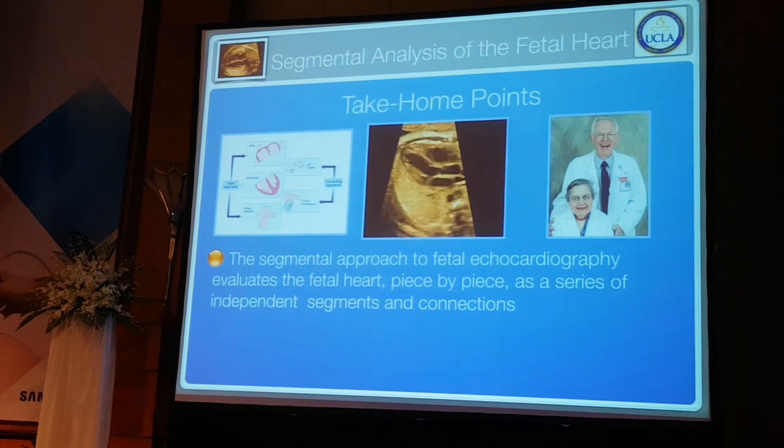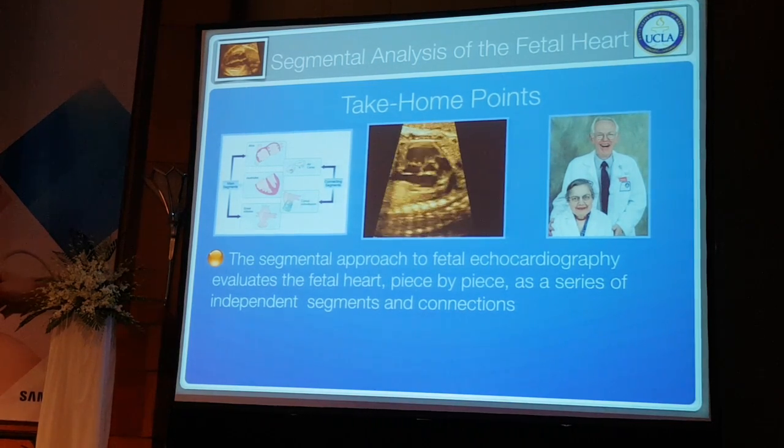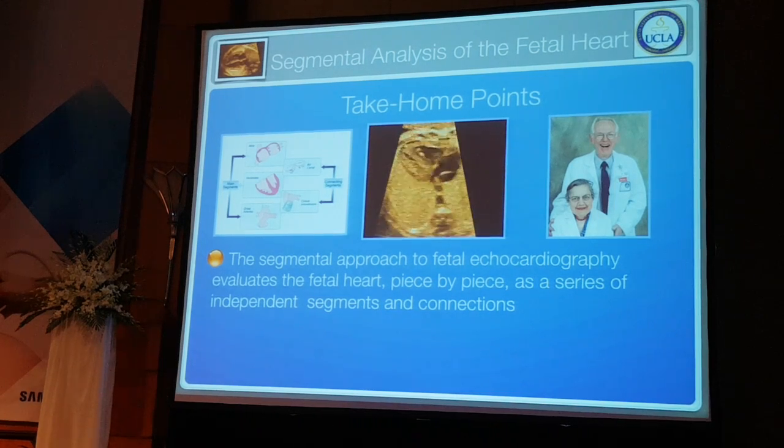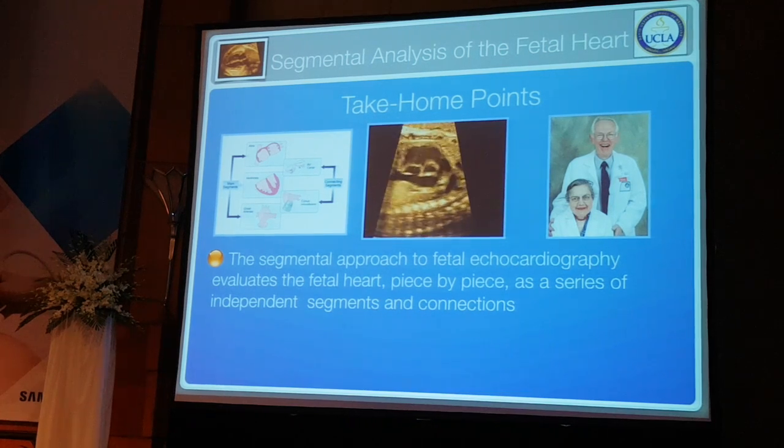Are you seeing everything that you're supposed to see well when you're doing that four-chamber view? Sometimes when I'm scanning, it's a very difficult window, and I can see a portion of the four-chamber view. Maybe I'm seeing the mitral valve really well, or the left atrium really well, or the crux, but I'm not seeing other parts.